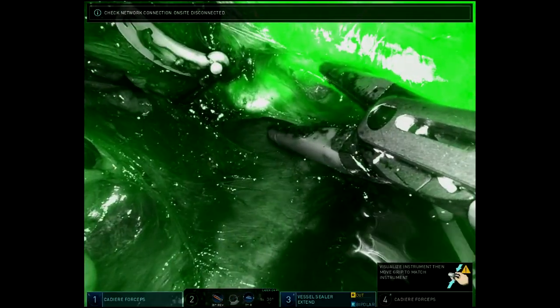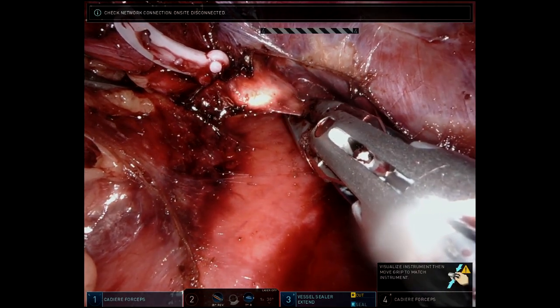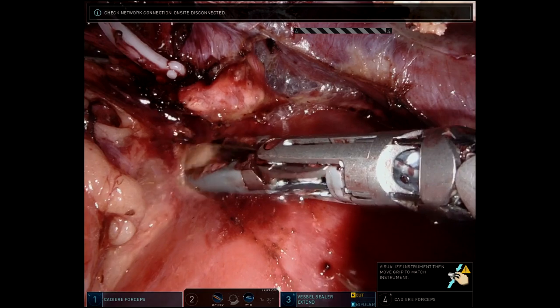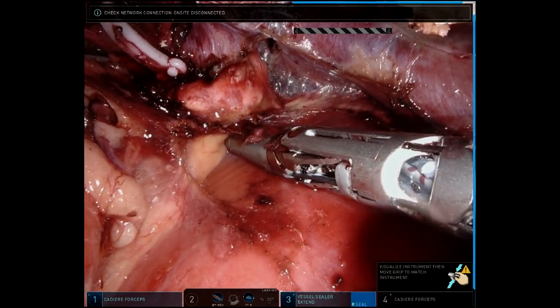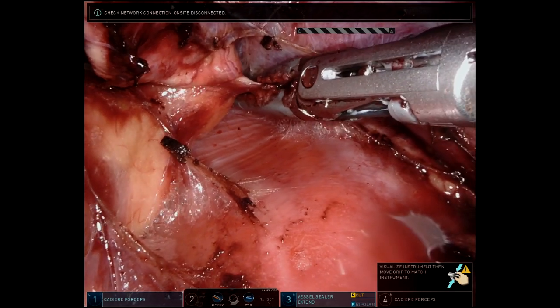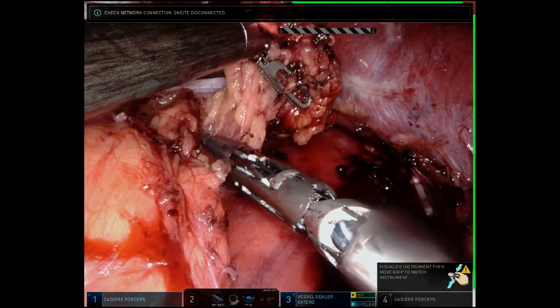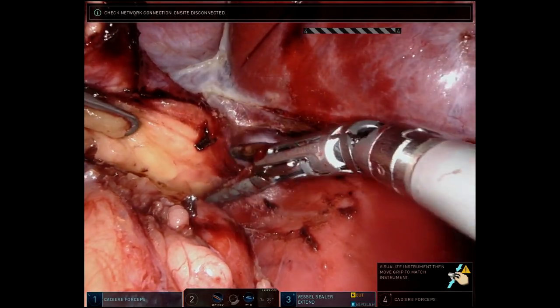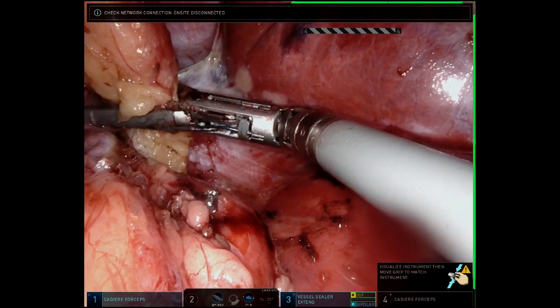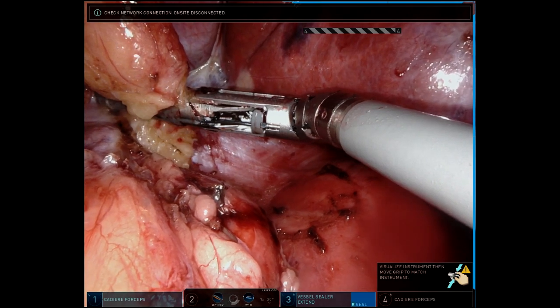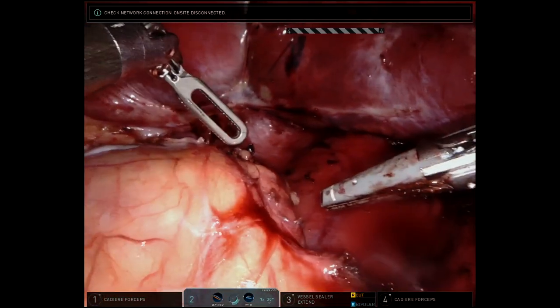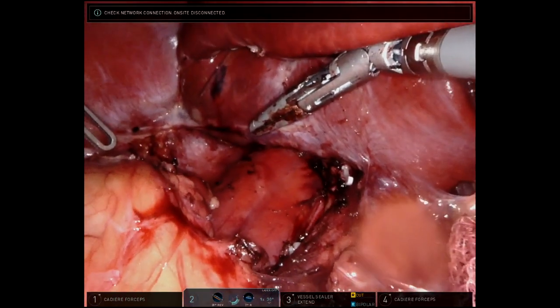The dissection is continued along the superior aspect of the adrenal gland. Firefly is again utilized to identify the superior border of the adrenal gland. As the dissection continues laterally, the retroperitoneal fat is cleared from the psoas muscle. Inferiorly, the retroperitoneal fat is cleared from the superior aspect of the kidney. This dissection continues laterally to the level of the peritoneal reflection. At the conclusion of the procedure, the psoas muscle and superior aspect of the kidney will be cleared of retroperitoneal fat, extending laterally to the peritoneal reflection and medially to the inferior vena cava.